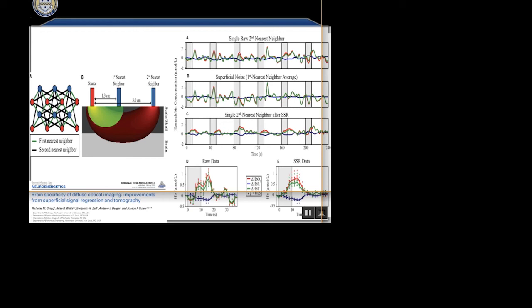The long one is measuring both superficial and deeper. So you can use that short distance as a local estimate of this noise structure, design your filter based on that, and then apply your filter to remove that same noise structure from the farther distance.